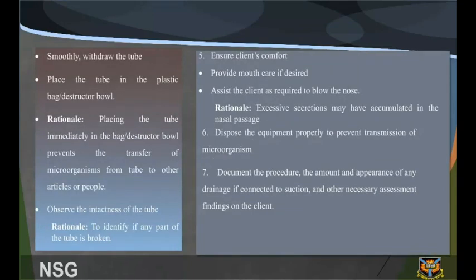Smoothly withdraw the tube. Place the tube in the plastic bag and destructor bowl. Rationale: placing the tube immediately in the bag or destructor bowl prevents the transfer of microorganisms from tube to other articles or people. Observe the intactness of the tube to identify if any part of the tube is broken.